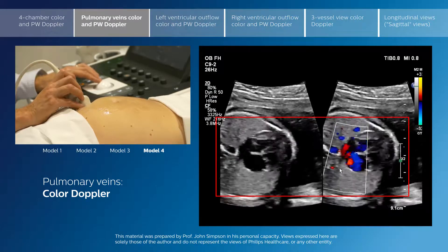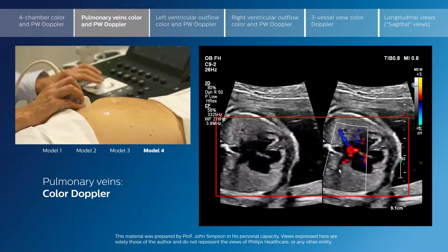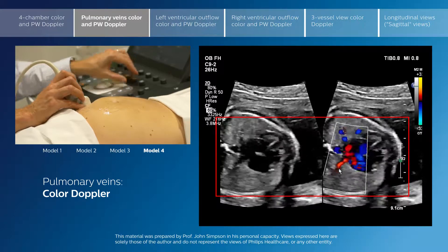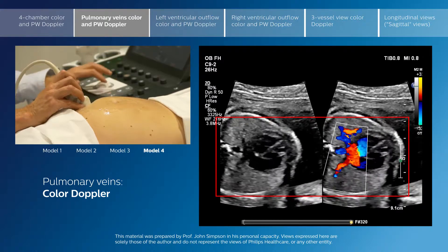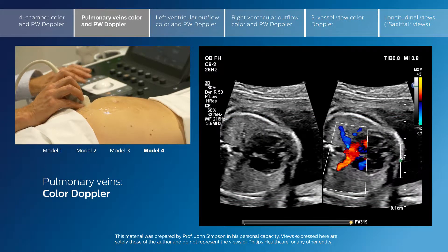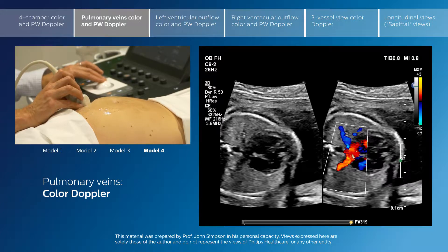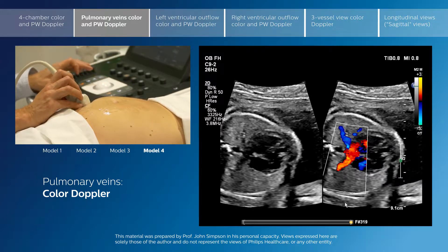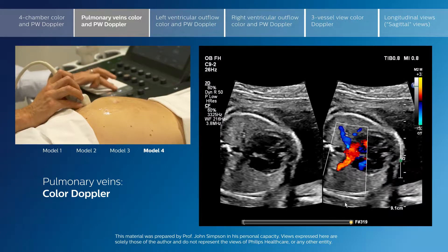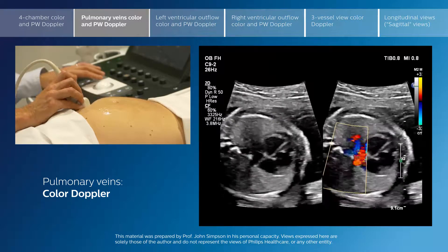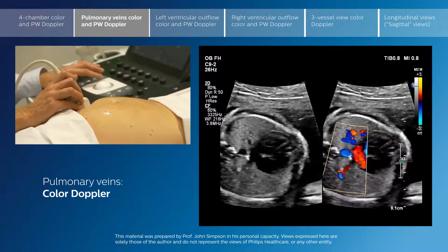So we are confirming that those pulmonary veins do actually come back to the left atrium. If I just freeze it here — freeze frame is a good modality for the pulmonary veins. We can see very nicely that the pulmonary veins on the right are coming back to the left atrium, as are the pulmonary veins on the left. I've had to adjust the color scale downwards; currently it's around 33 centimeters per second, to make sure that we're able to visualize the low velocity pulmonary vein flow.